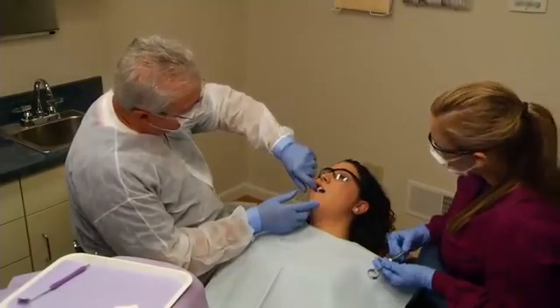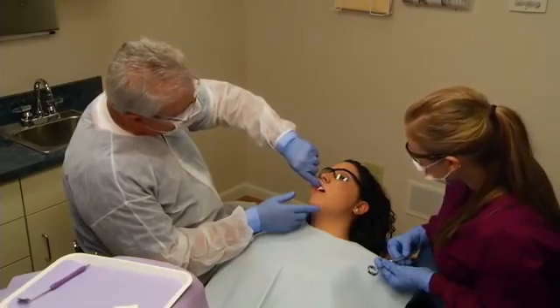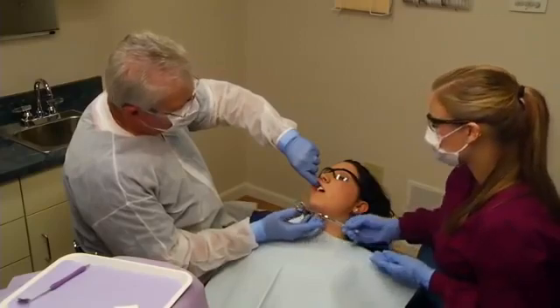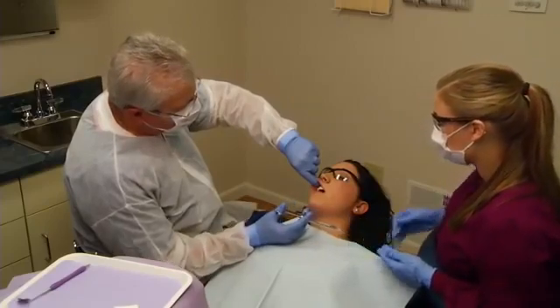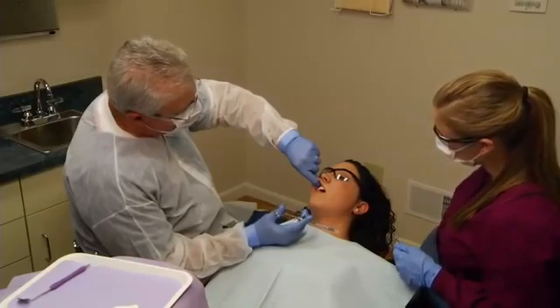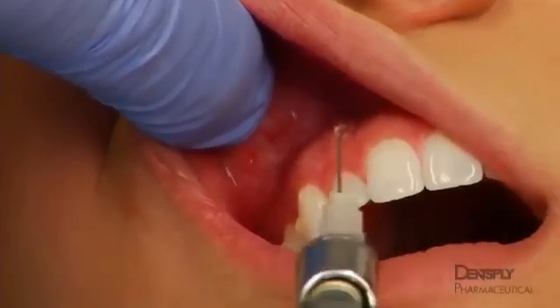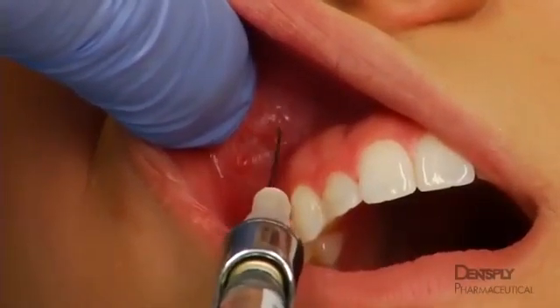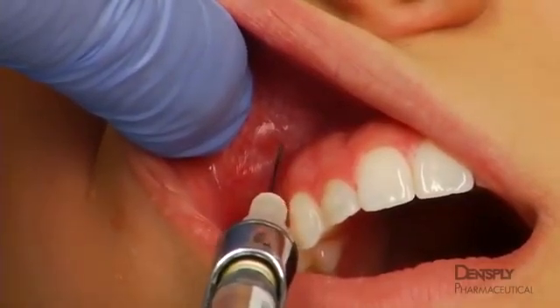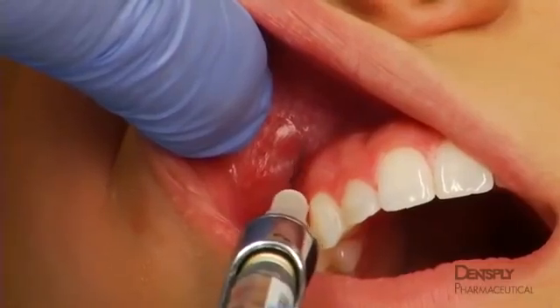Palpate the alveolar mucosa tissue at the injection site in the vestibule at the height of the mucobuccal fold superior to the apex of the maxillary canine, just anterior to and parallel with the canine eminence, to ensure only soft tissue is injected. Using a 27-gauge short needle, orient the bevel of the needle away from the large window of the syringe to ensure the bevel orientation is toward the bone. Place the syringe parallel with the long axis of the tooth.